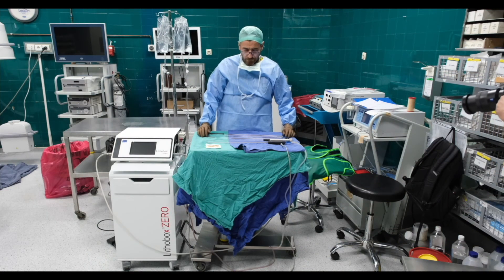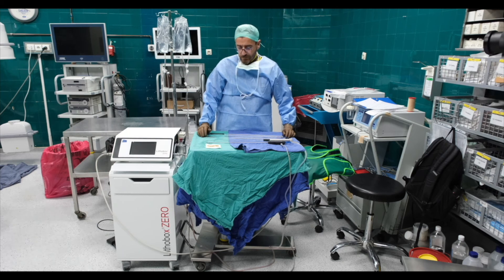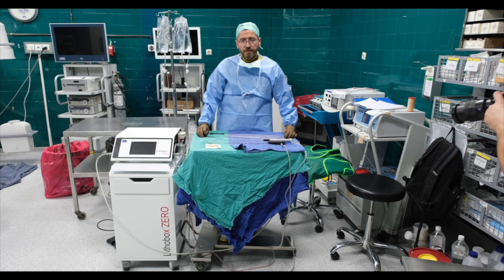Our surgery lasted about an hour and the lithotripsy phase was around 30 minutes for this complete staghorn stone. We mainly used ultrasonic lithotripsy, but for some parts of the stone with the mini-nephroscope we also used ballistic lithotripsy. It was quite effective and we successfully treated our patient with complete stone clearance.